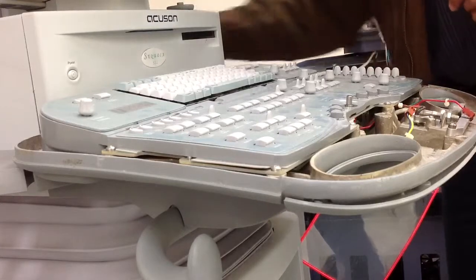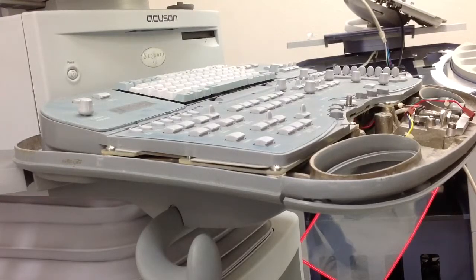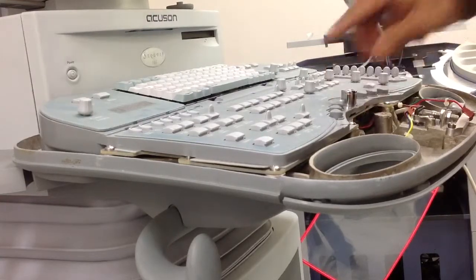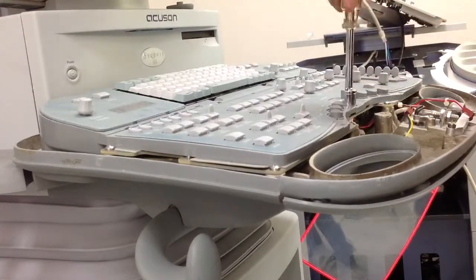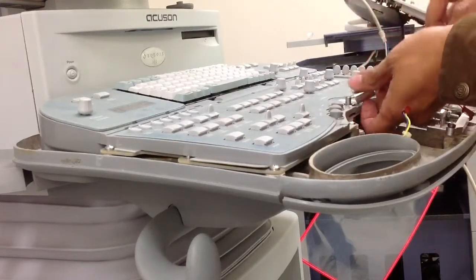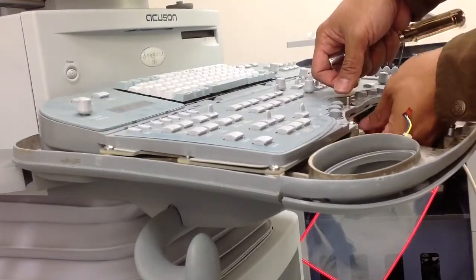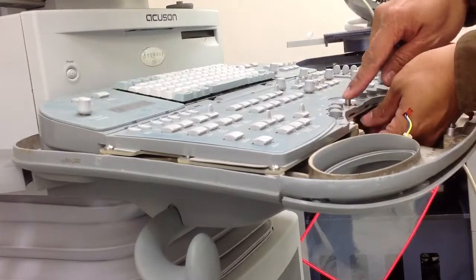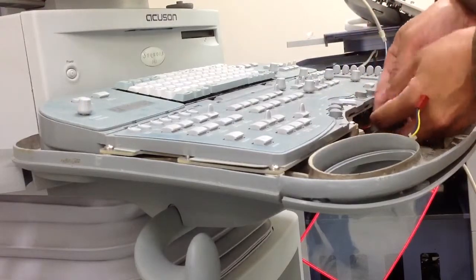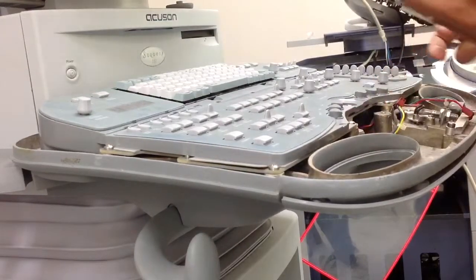And then here is the time where you're gonna use the hex wrench. Remove the nut. Once you remove that, just push the freeze module and then unplug the cable or pull down the cable at the bottom, and that's it.